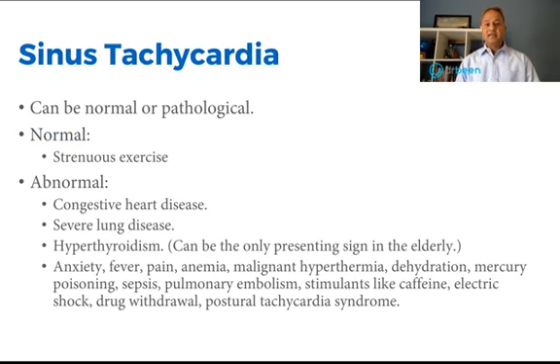Now, sinus tachycardia. So let's look at these types, the arrhythmias at the SA node or due to the SA node. Sinus tachycardia is when the SA node is intact, it is working, and it is causing increased heart rate. It can be totally normal. You start doing exercises right now, you start running around, jumping, and your heart rate would increase. That is sinus tachycardia, no problem. Don't try to fix it. However, in abnormal states as well, sinus tachycardia can occur. So what are those states?